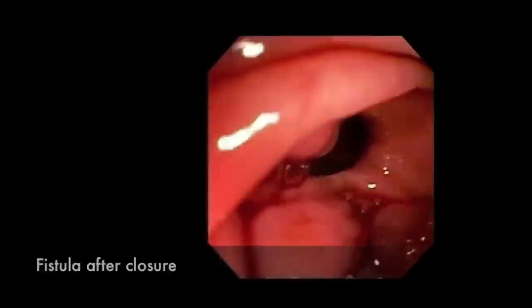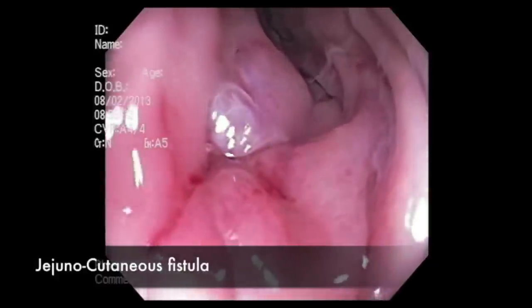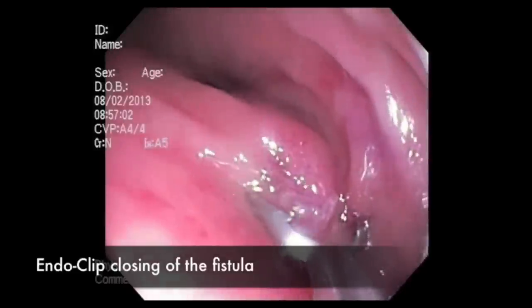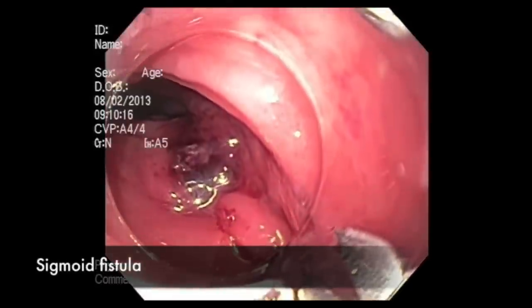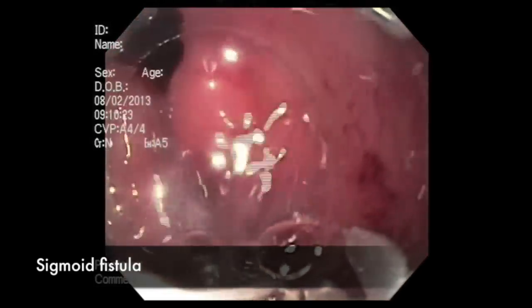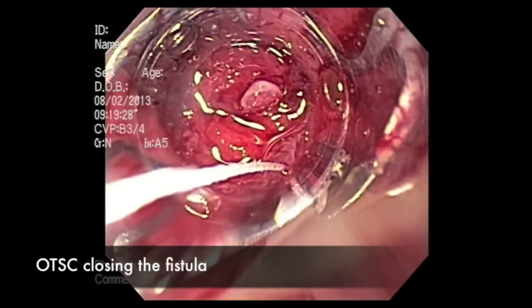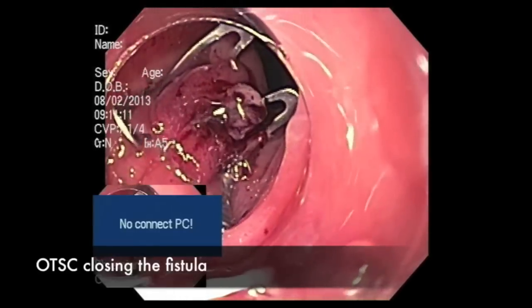A simultaneous closure of jejunal and sigmoid fistula was further performed. One can see the jejunocutaneous fistula — this small fistula was closed with a single endoclip. Simultaneously, a second team using a colonoscope attempted the closure of a sigmoid fistula, once again applying suction on the cap to allow delivery of the over-the-scope clip.